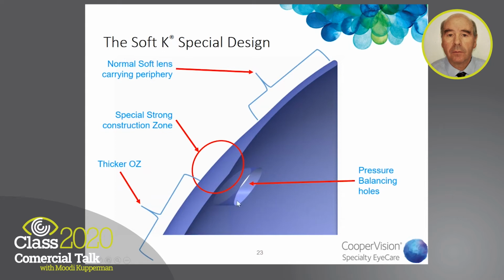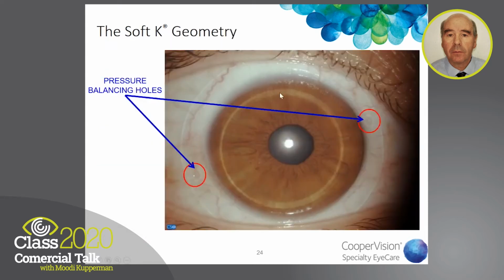We also thought about deposits in this area, but we found a way to make this area smooth, and of course the other side too. When we clean this lens daily with a hydrogen peroxide system, we get for a year a very nice and clean hole without any deposit on it. We can see here a nice picture of this lens.